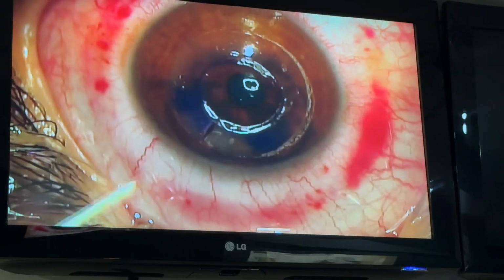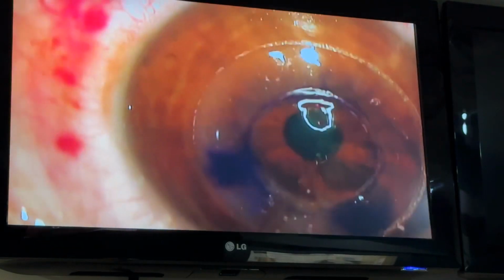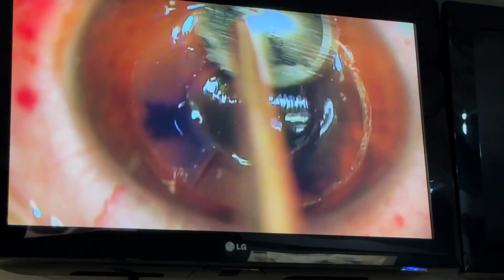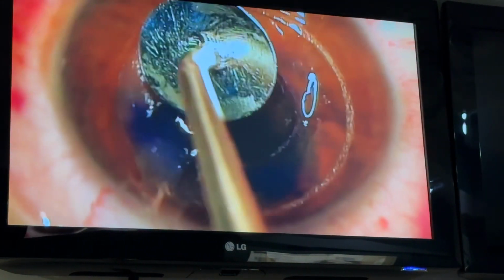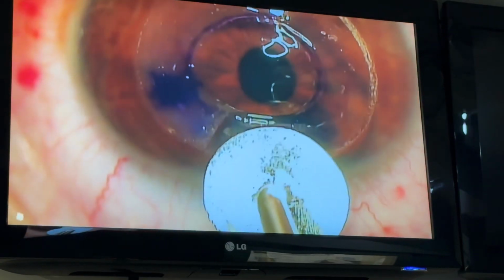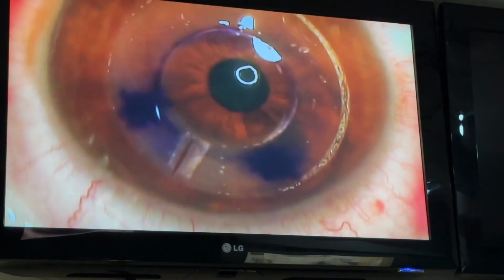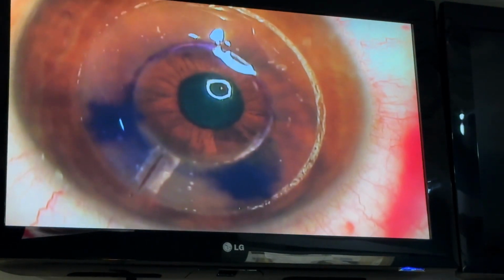This patient's under simple topical anesthesia and oral Valium, and he's tolerating the procedure very well. Relatively simple for him, and I'd say surgically, relative to the other work we do, not too complicated here. So I'm finally going to make sure that the position's quite right and just massage that inlay. And once it's fully massaged, you'll see that, again, it's centered on that cone, which was just superior to the visual axis.